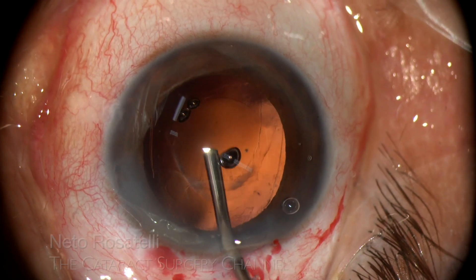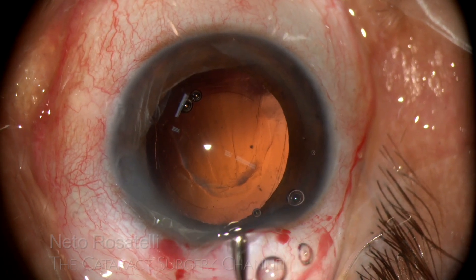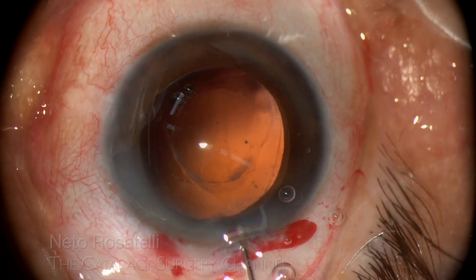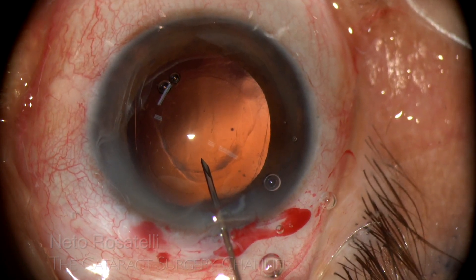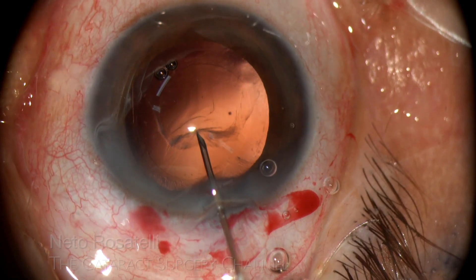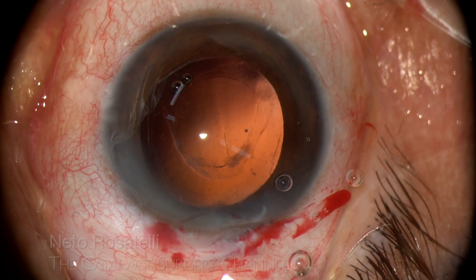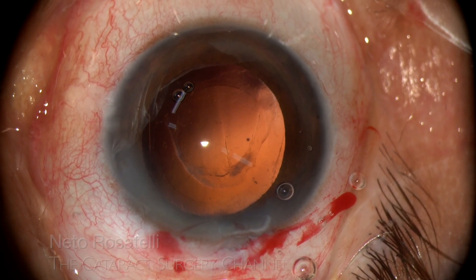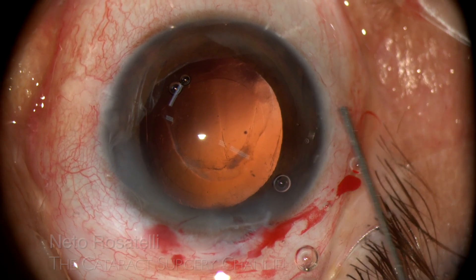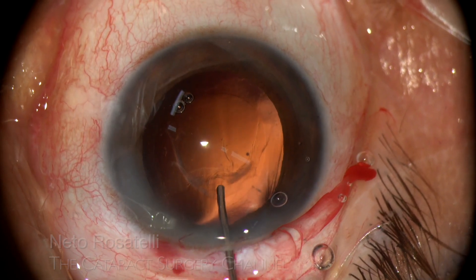The key is not to fill the bag too much, so here I titrate a little until the point I want. If too much filled, you will have a steep axis angle to the capsule and the tendency of the capsule to run is greater. I use a 30 gauge needle to slightly open a hole in the capsule, and you can see that while penetrating the capsule I lift it to separate it from the anterior hyaloid and avoid rupture in the latter. This tiny hole is enough.